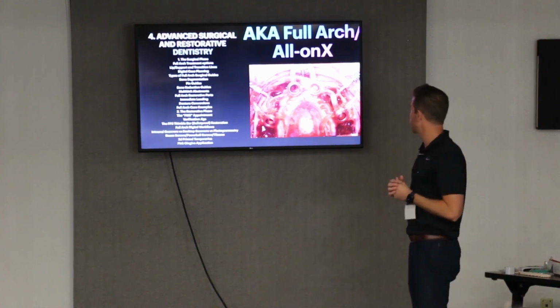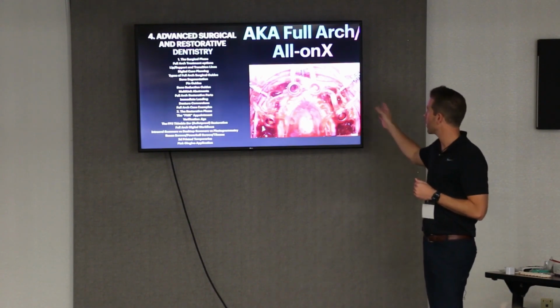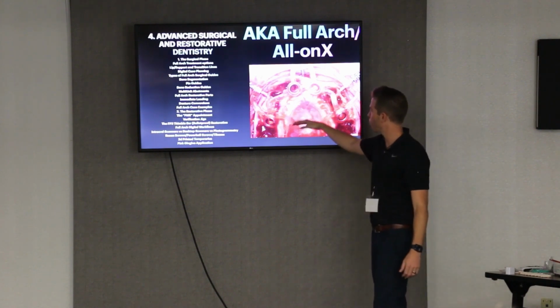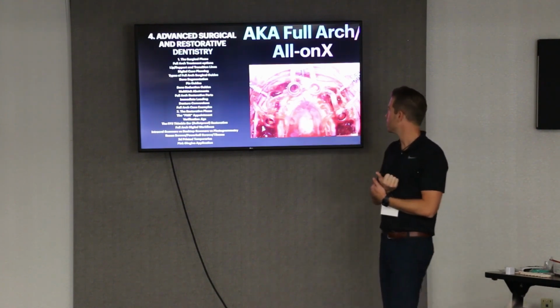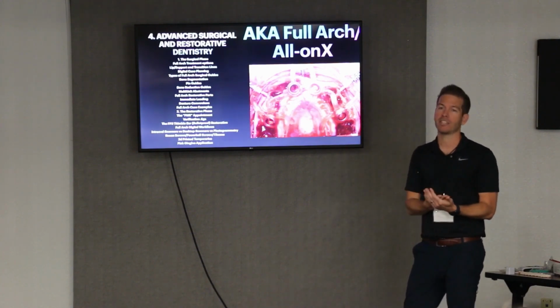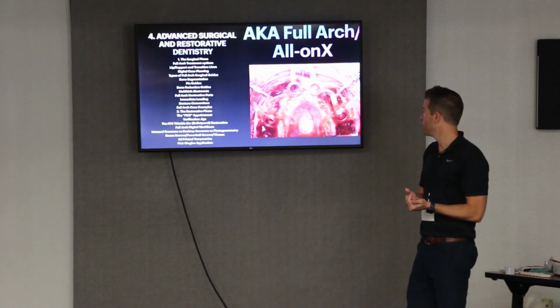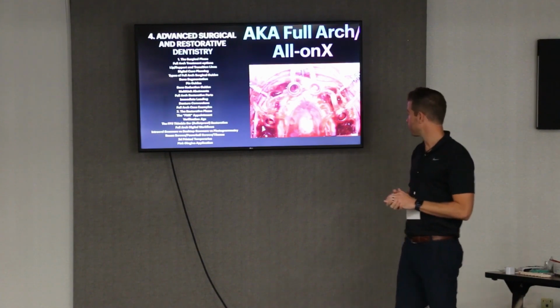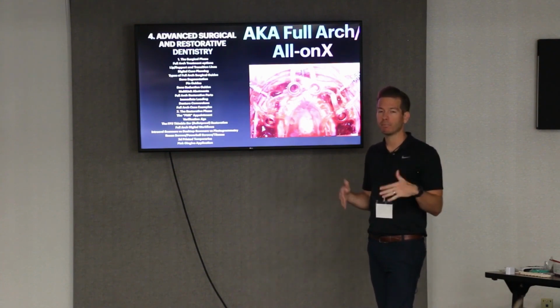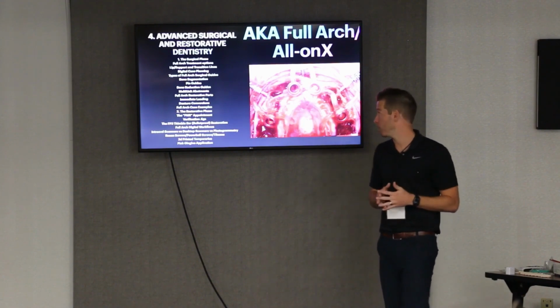So I like this picture. This is a cool example of a surgical guide. It shows you various aspects, pins and tubes and metal sleeves and palatal support, a complex guide that was designed. We're going to focus on what's a predictable full arch guide that we can start doing Monday when we get back to our practice. I think that's super important, keeping this simple, because you can get really, really complex with guides. But we found a way to really simplify it to be fast, efficient, and easy to understand for anybody that's kind of new.